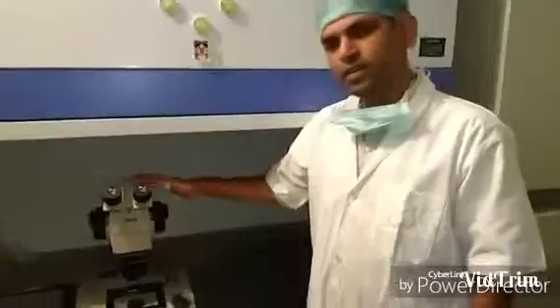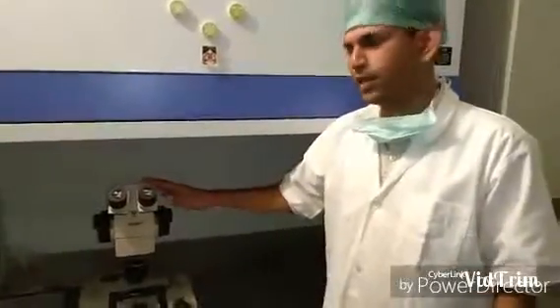We need to regularly clean the microscope using disinfectant. We usually clean the microscope in the morning before we start the procedure using 6% hydrogen peroxide.